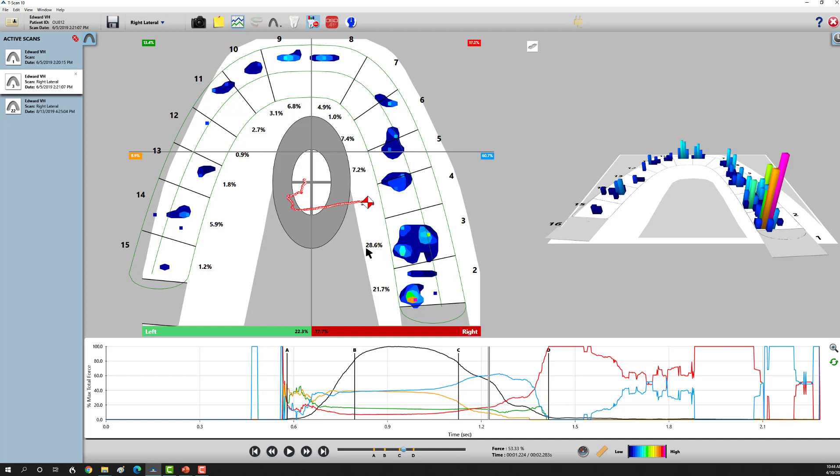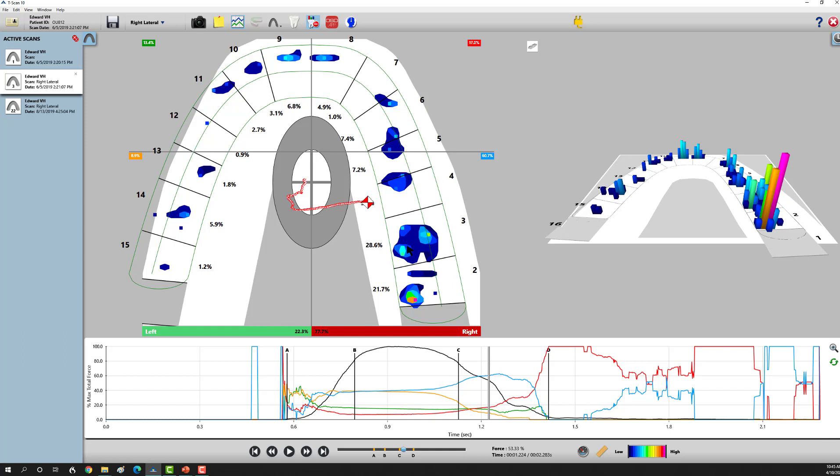His braces got taken off when he was in 10th grade, and now he's in college. It's just a matter of time before this wears down and this one starts taking the brunt of the force. Or, if the tooth is not wearing down, the bone and gums will take the brunt of the force. How do we correct this?